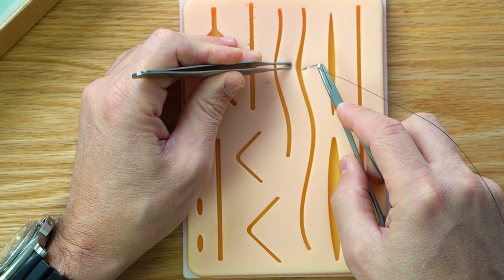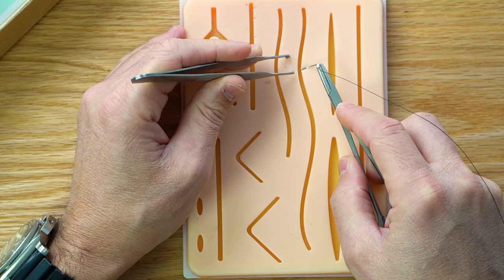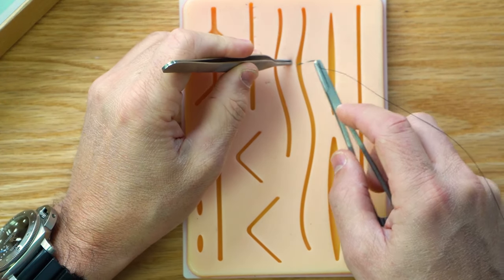here. Now this is gonna be a little bit different because this is obviously not skin. So this subcuticular stitch goes actually in the dermis. When you open up the skin, it's gonna be the very white layer. It's just underneath the epidermis, right? The epidermis looks very flesh colored, and then the dermis is the thing that's very white underneath.